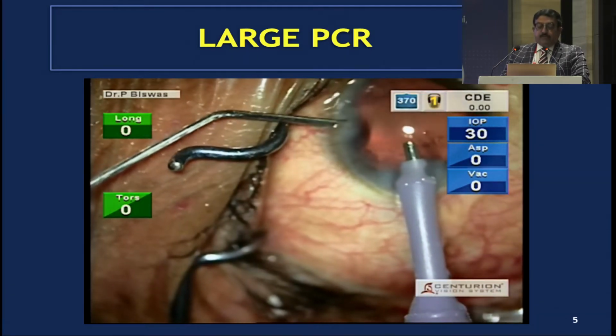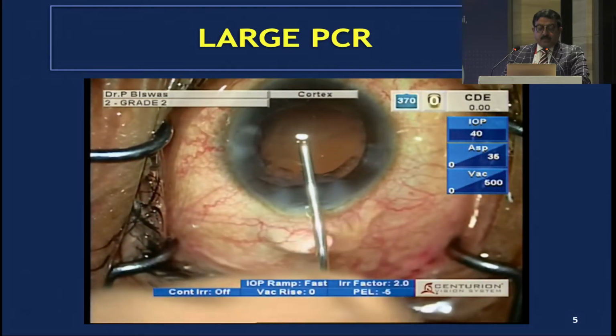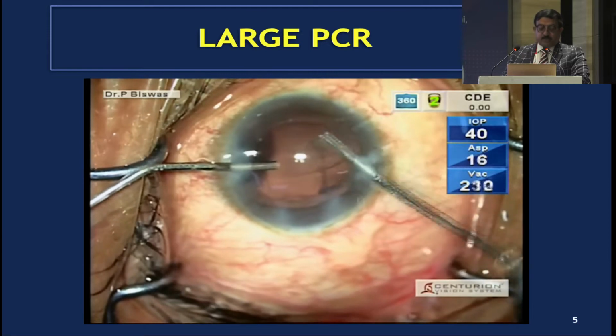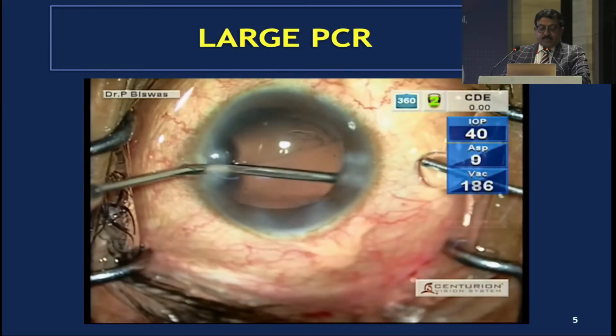Not to remove the phaco needle, of course, while the methyl cellulose gets filled up into the bag, and then only gradual assessment of the posterior capsular rupture has to be made, how much of it is gone, and then going ahead to placing the intraocular lens.